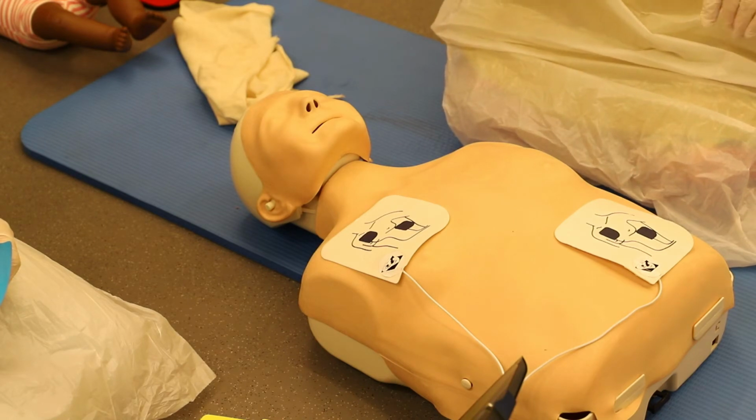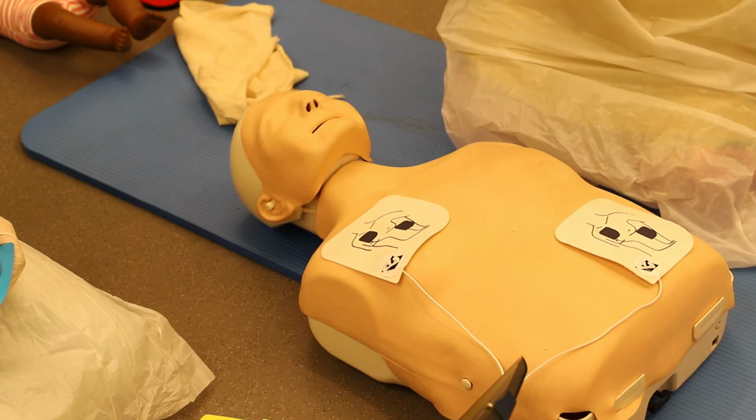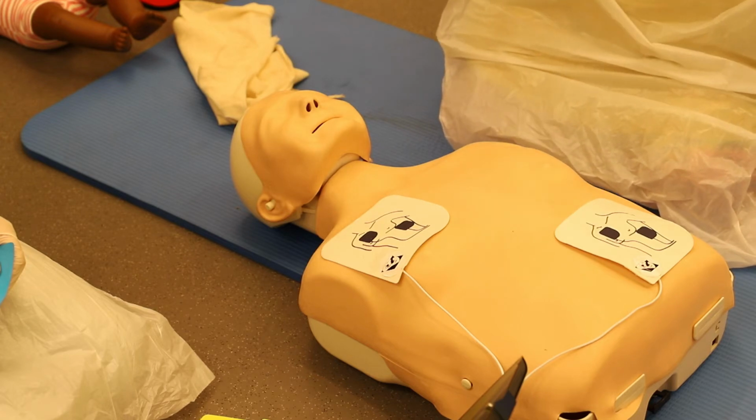Charging. It can't find a heartbeat. Stand clear. Make sure your colleagues and yourself are not touching the casualty. Shock will be delivered. 3, 2, 1. Shock delivered. Okay? It is now safe to touch the patient.